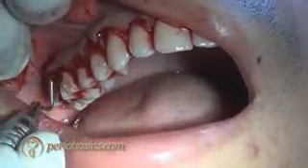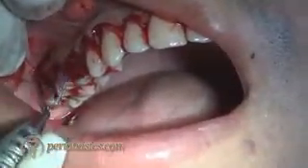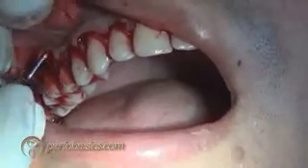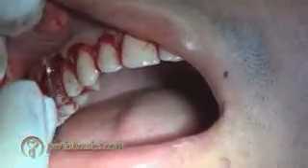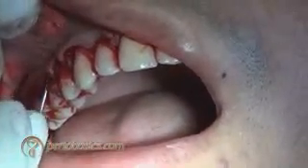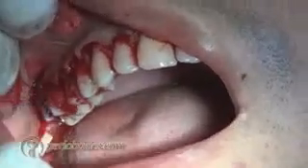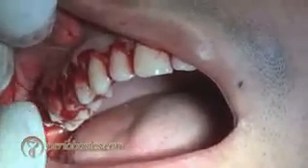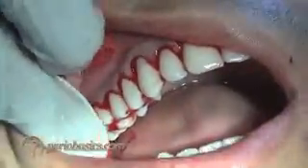Now the third incision, or the horizontal incision, you can use an Orban knife for that, or otherwise you can use a simple curette and then you can pull the wedge of the tissue out of the flap. You can see that the wedge of the tissue is coming out. This is the tissue which contains the pocket lining.